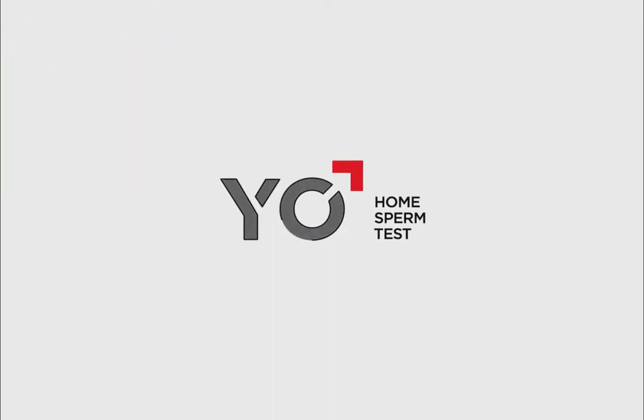Welcome to How Yo Works. This demo will show you how to test your sperm step-by-step using your Yo device.